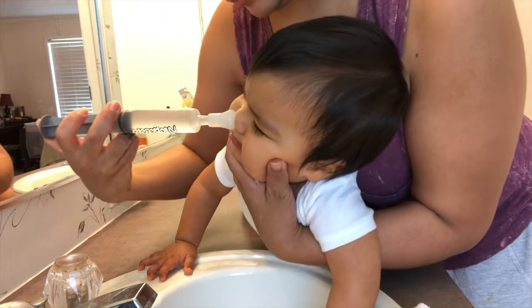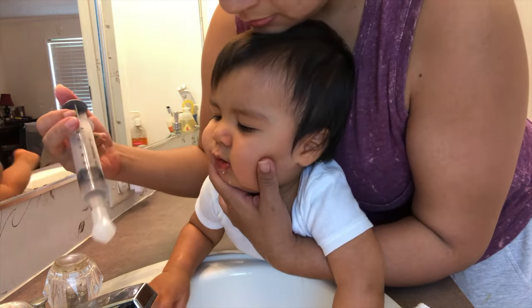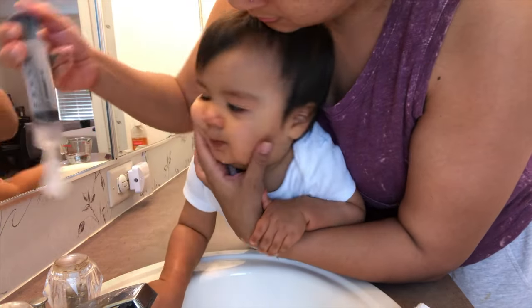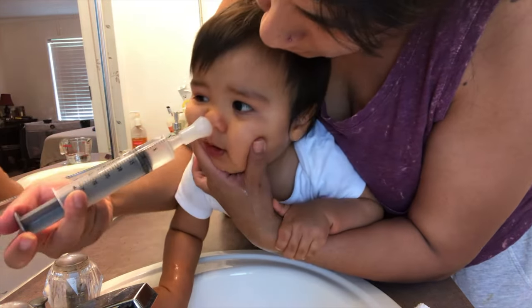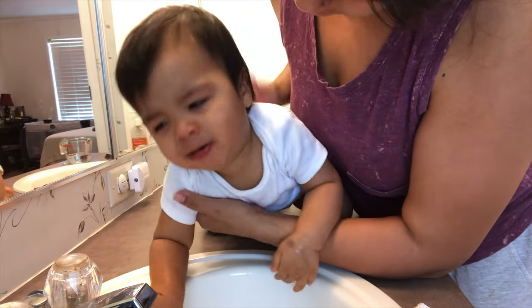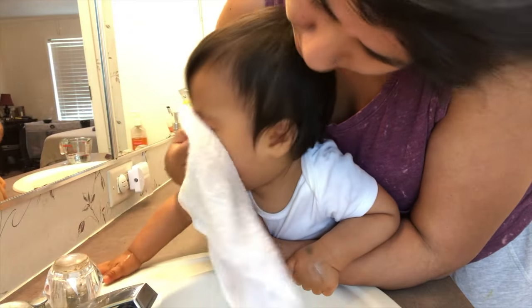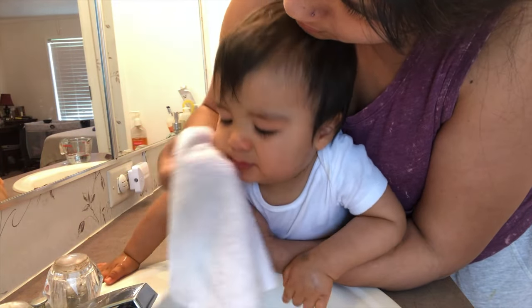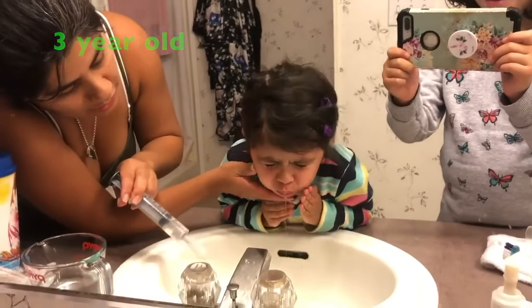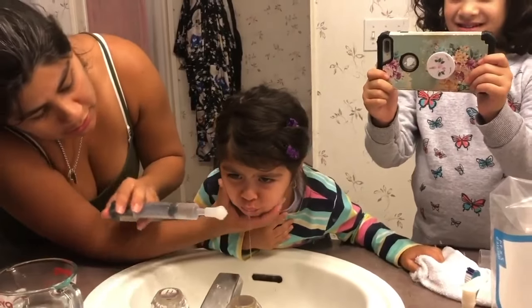Good job. I love that. One, two, three — there you go, just wait, wait. Okay, let me do it again.